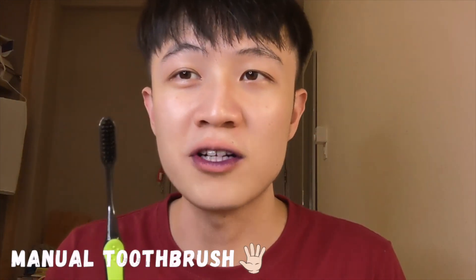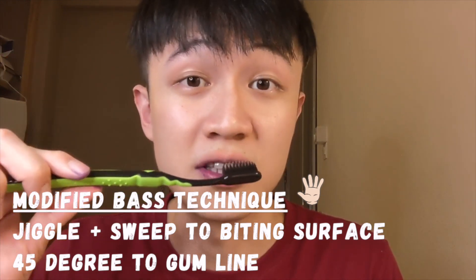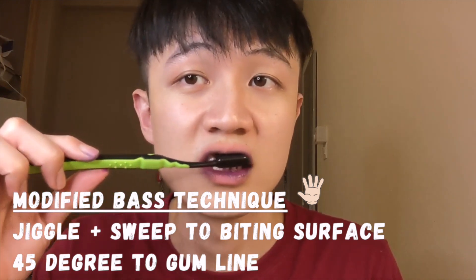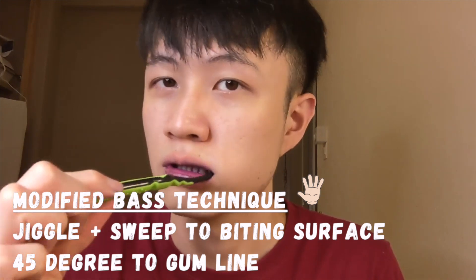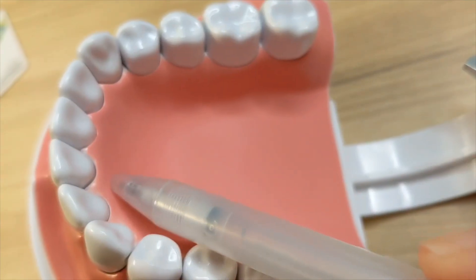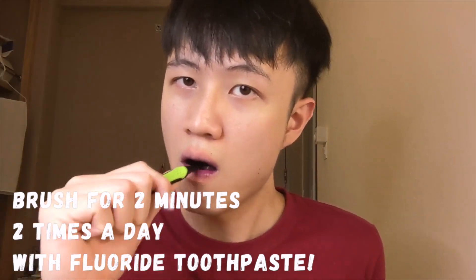Now I'll be using the manual toothbrush to brush the left side of my teeth. For the manual toothbrush, we'll be using the modified Bass technique. That means we'll be angling the toothbrush at a 45-degree angle again towards the gum line, and we'll be doing a jiggling and sweeping motion. It's very important to ensure that you're brushing along the gum line to effectively remove the plaque in that area. For the surfaces facing the tongue — the lingual surfaces — you go one tooth at a time in a vertical stroke.